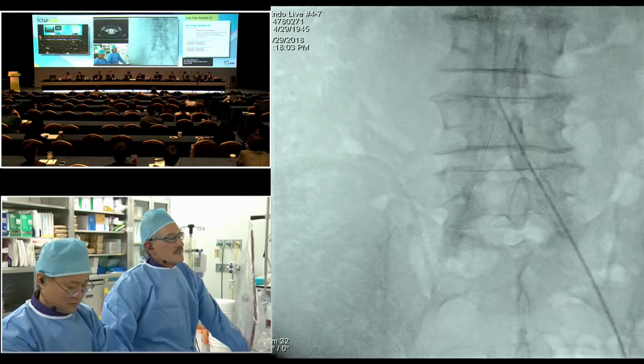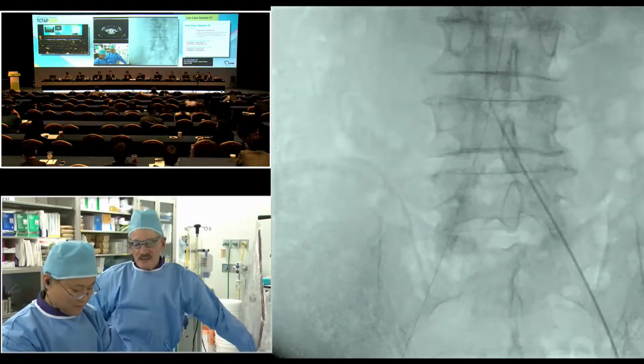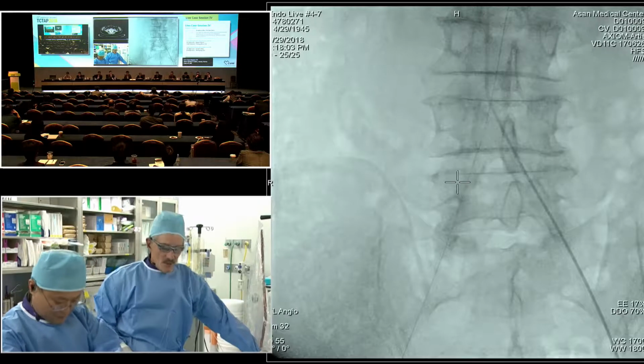Okay, we're about to dilate here. Balloon's going in. We have a 3.0 by 80, I think. 018 balloon.